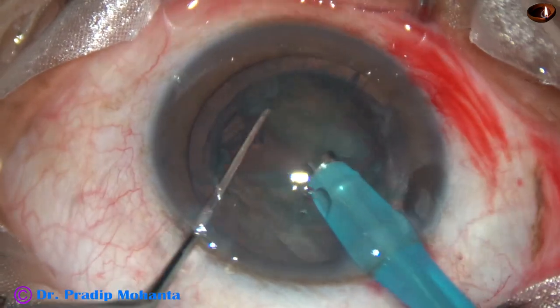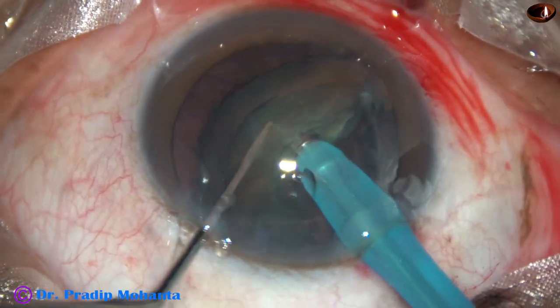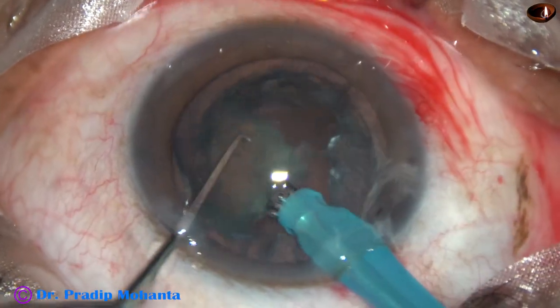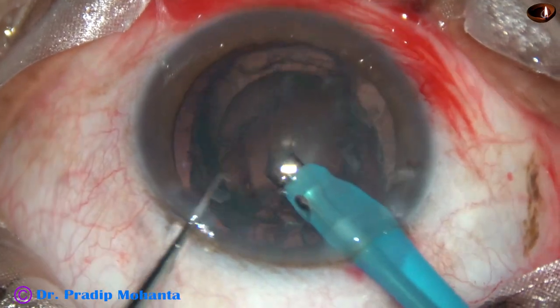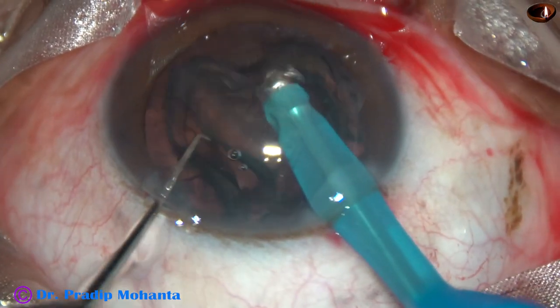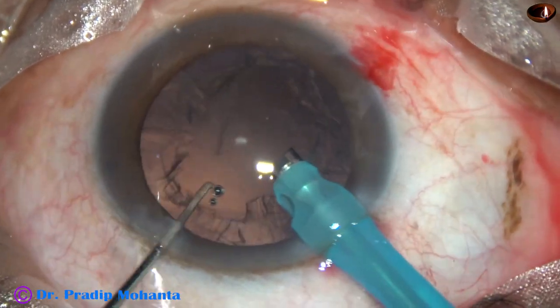This is another fragment divided into two pieces. This is the other heminucleus divided into two fragments, and they are emulsified and removed. This is the epinucleus. The epinucleus got removed in no time.